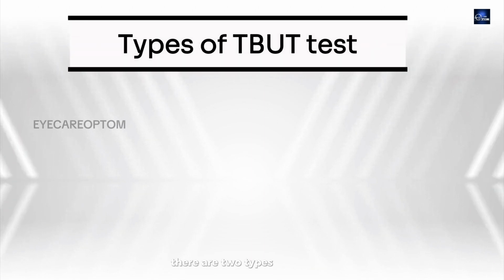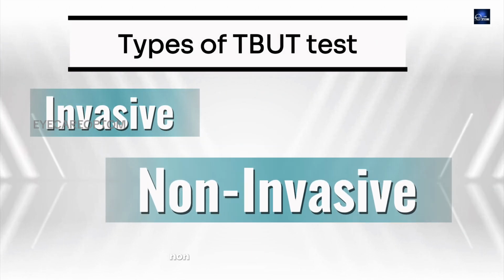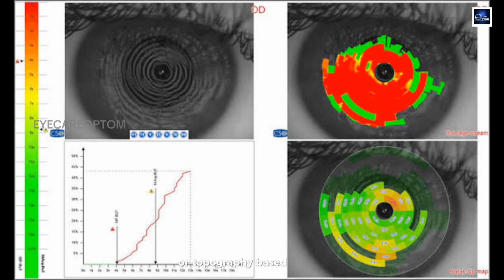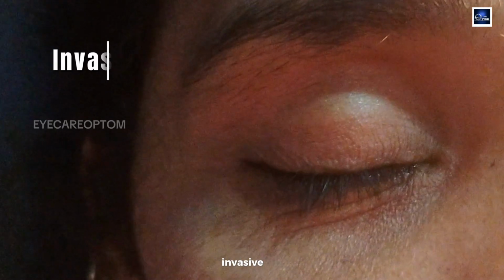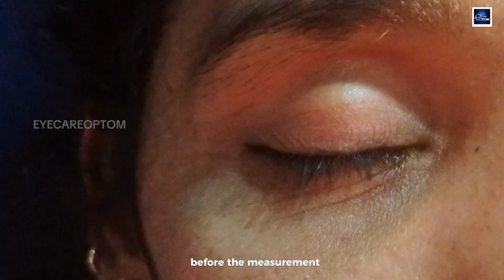There are two types of TBUT tests, invasive and non-invasive. Non-invasive TBUT measures the tear breakup time without adding anything to the eye. It uses instruments like a keratoscope or topography-based systems to observe the natural tear film directly. Invasive TBUT involves instilling fluorescent dye into the eye before the measurement.